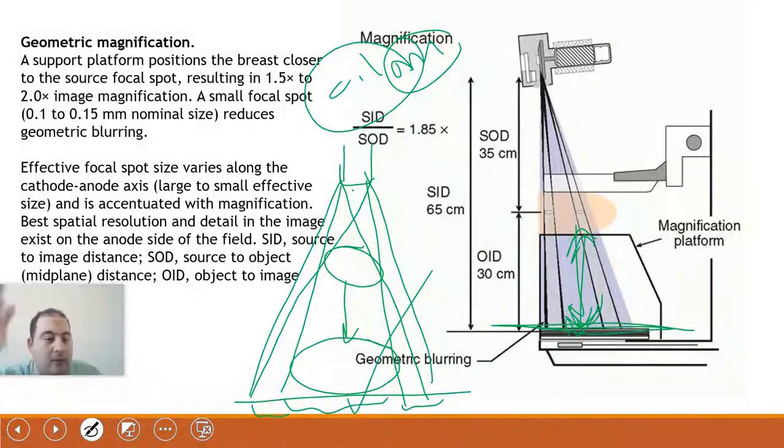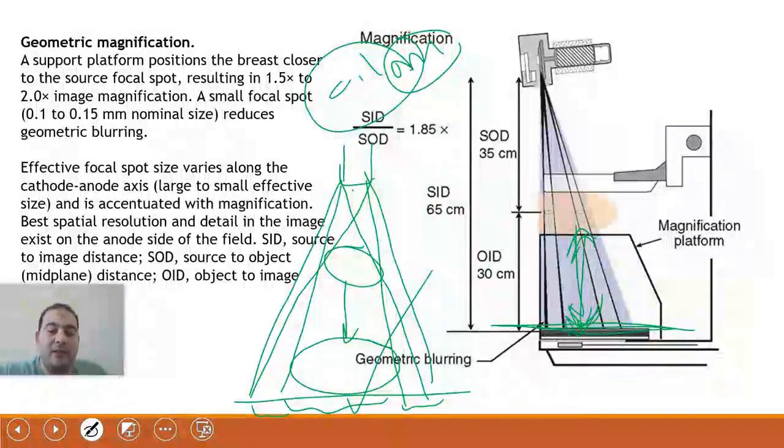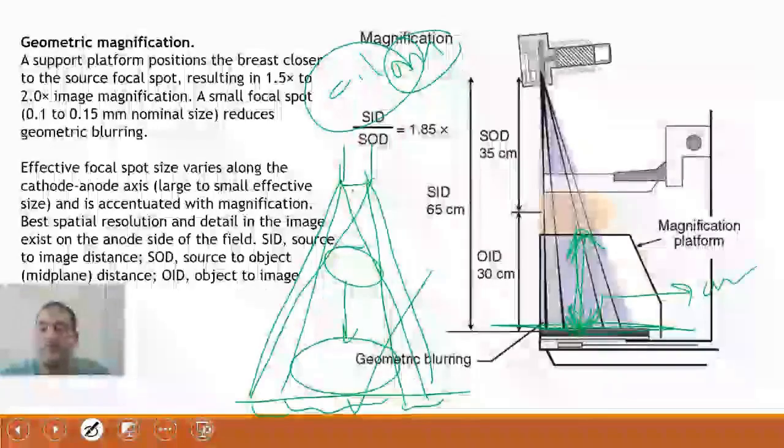Do all mammograms move and take images? There is an imaging technique that involves microcalcification. In this case, there will be a distance. Why do they call it the air gap?